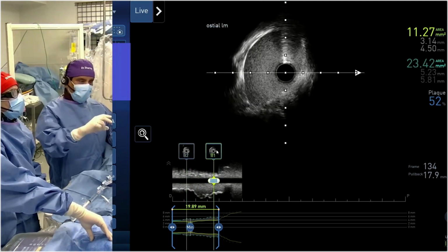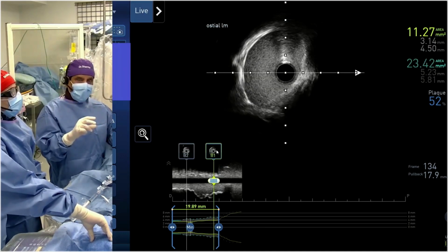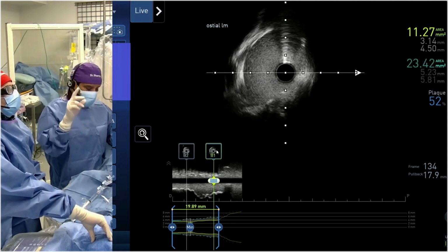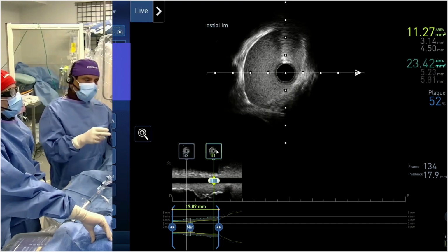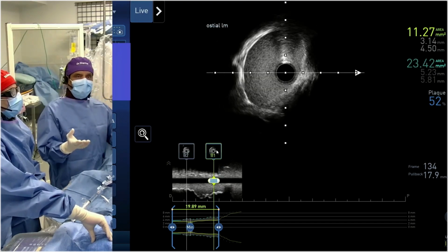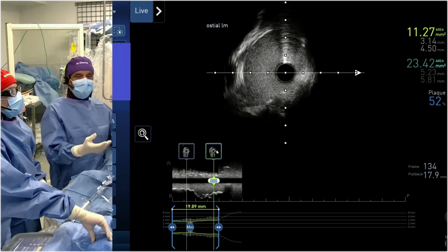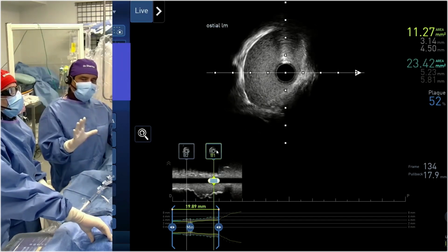I have always been saying that 10% of lesions are severely calcified, and we need to modify those lesions. So that is happening at present, a combination of IVL and atherectomy. What La Sala said is that 20% of cases are done with atherectomy plus IVL, but in the majority of those cases IVL is done post rotablation, and that's what we do. I have yet to do a case where we did IVL first and then Rota, because the IVL key is that we will know if you can advance the IVL.